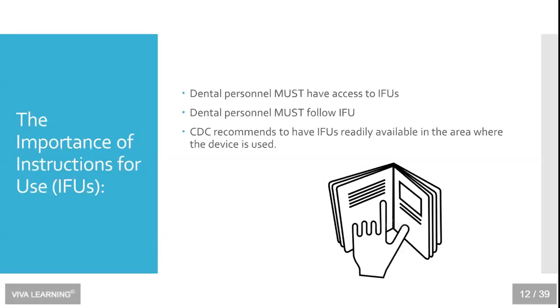Many state dental boards require that you are indeed in compliance with CDC guidelines. And if you are in one such state, you don't have a choice in the matter. You are legally obliged. For all other states, know that you are indeed under OSHA regulations, and OSHA does refer to CDC guidelines quite often. So keep that in mind as well.